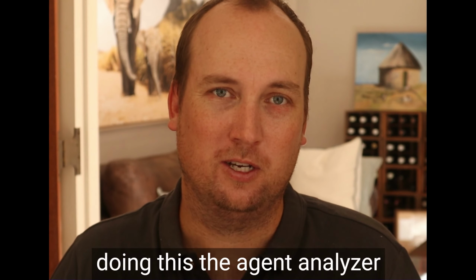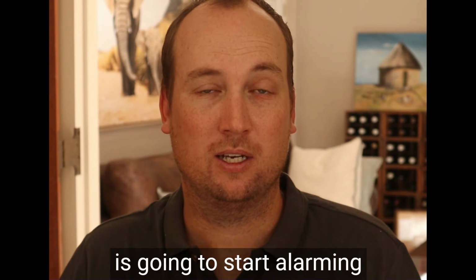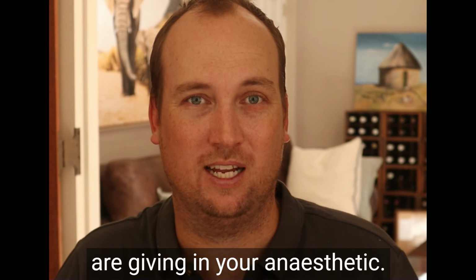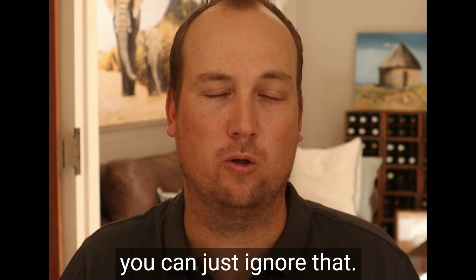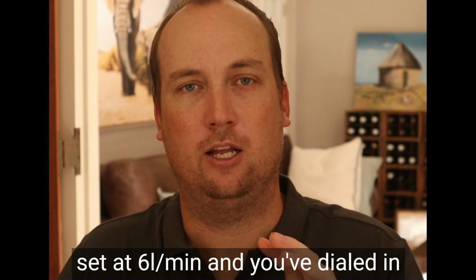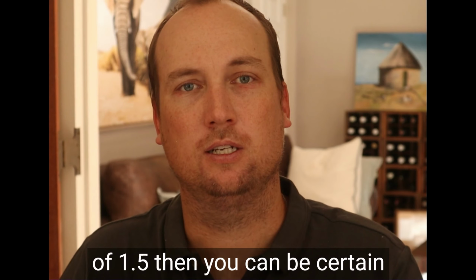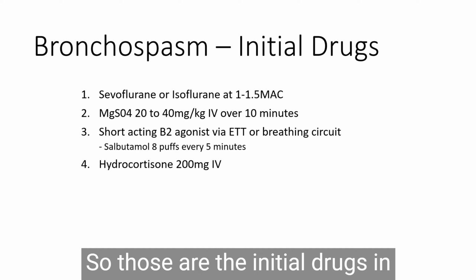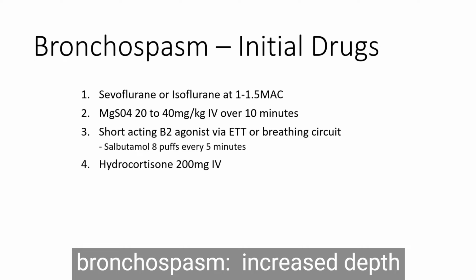And just note that while you're doing this, the agent analyzer from your gas analysis module is going to start alarming, because it's going to pick up the salbutamol and it's going to be confused as to what you're giving in your anesthetic. And it will probably alarm that you're giving mixed agents or 2 agents, and you can just ignore that. If you have your fresh gas flow set at 6 liters a minute and you've dialed in your vaporizer to a MAC multiple of 1.5, then you can be certain that you're delivering a MAC multiple of 1.5 to this patient. So those are the initial drugs in the management of acute severe bronchospasm.